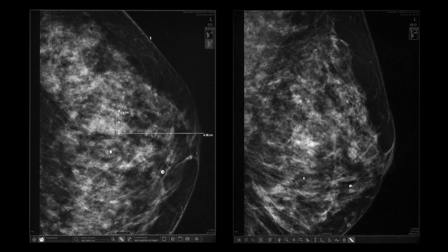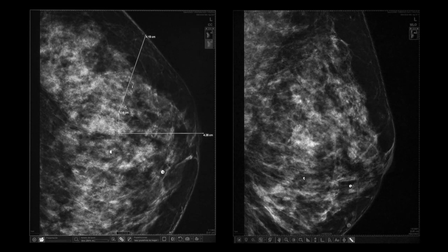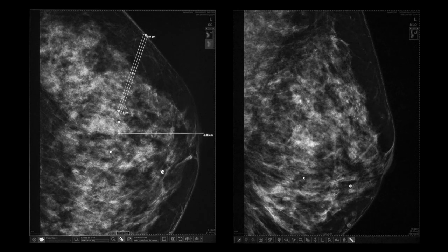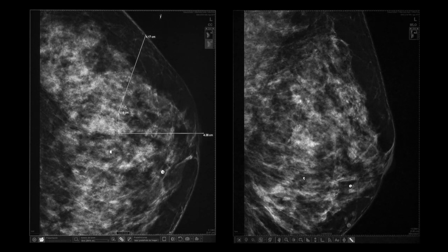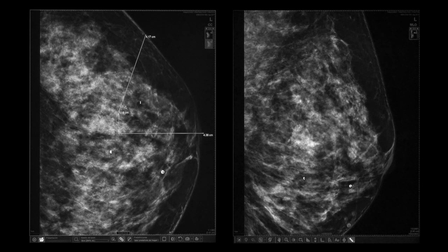It is also important to measure the distance from the skin to the lesion. This should be less than 84 mm for access with the standard N-Core needle length of 113 mm. In this case, it is 41.7 mm.